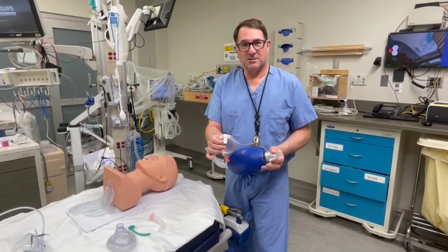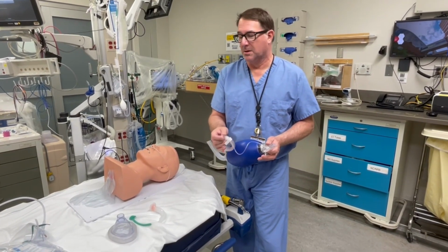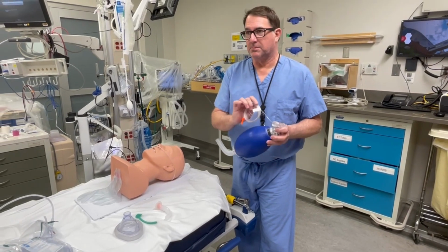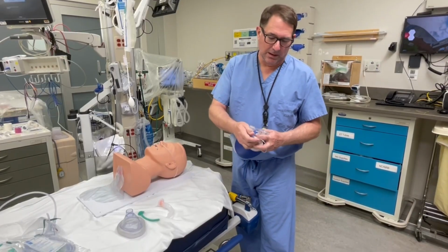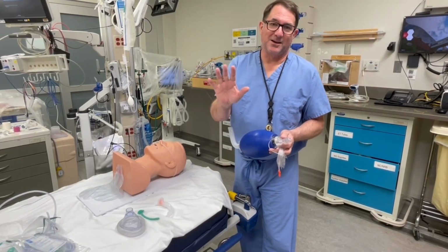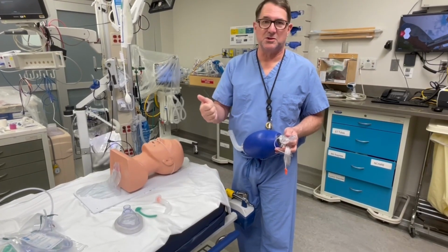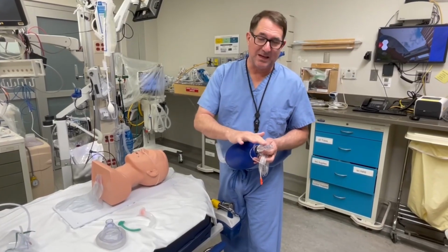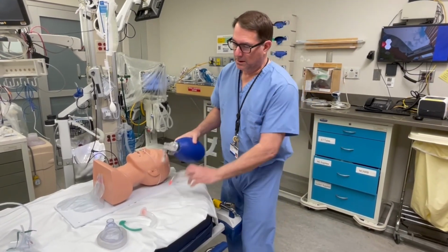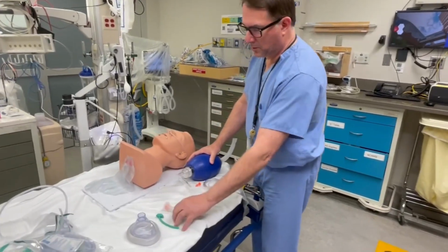Okay, so common things that I see: not using end-tidal CO2, not using quantitative end-tidal CO2. Absolutely not okay not to use this, okay? End-tidal CO2 gives us an idea on perfusion status, ventilation, and airway patency. You have got to have this on here, okay? And you're going to have your mask, your nasal airway and your oral airway.